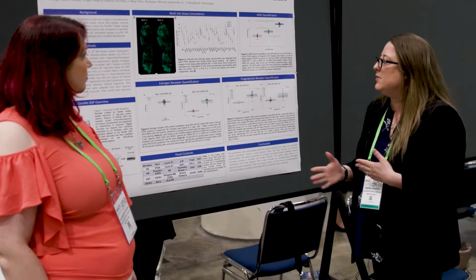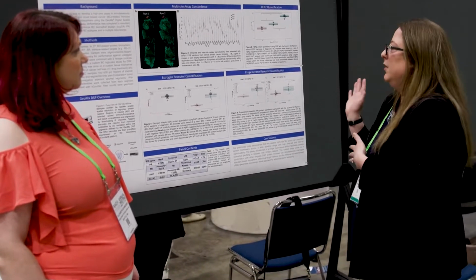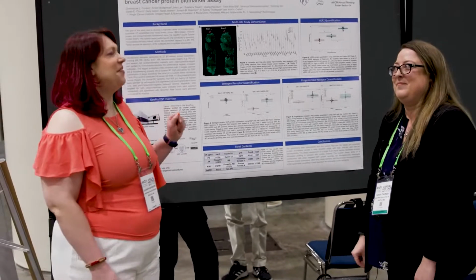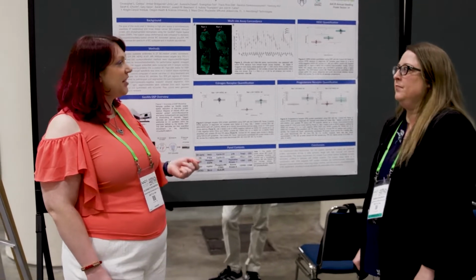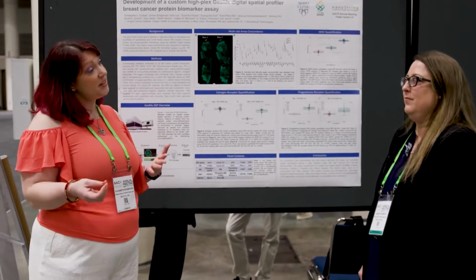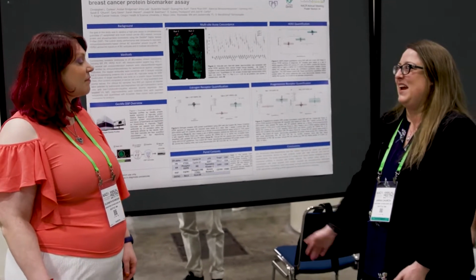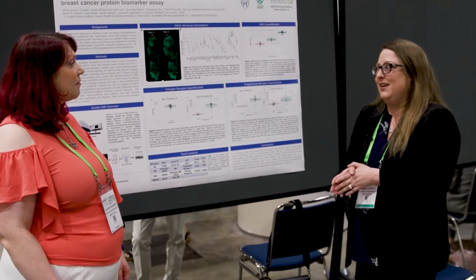So it's really nice to show that not only can you repeat this assay at different sites, but you can also really correlate the protein expression that comes off the custom assay with clinical assays. And then remind me again, this was done with nCounter readout, right? That's right. So that's another advantage of having that reproducibility and reliability where you're not sequencing the tags, we're just hybridizing probes on the nCounter too. Yeah, absolutely. You know, nCounter systems are already FDA 510(k) cleared, so that just reduces the variability in that readout.